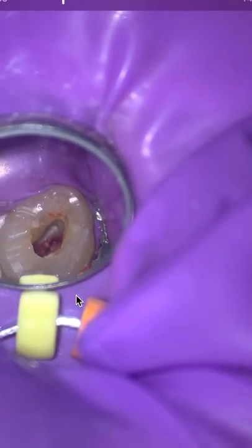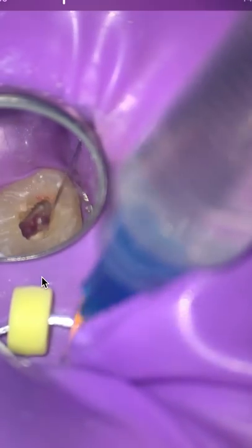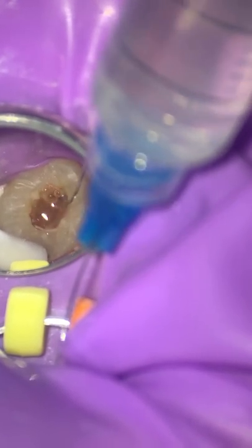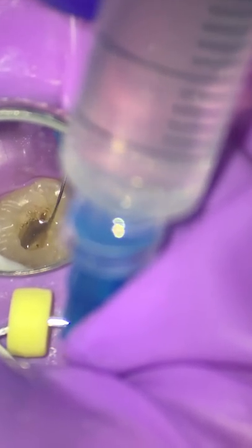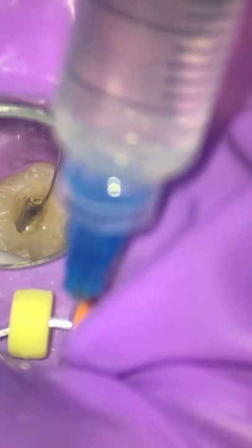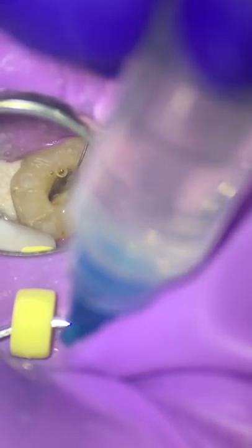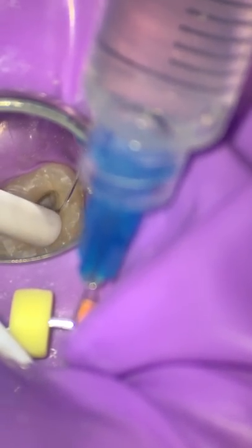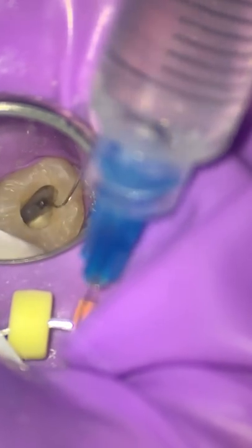I have another case, which I'm not going to put in this video, where the tooth had been sensitive to cold since the restoration for the last 2 years. Once we popped into that tooth, it just started hemorrhaging like crazy. But it stops. I'll see if I remember to put it in at the end of the video. Once you remove all the pulpal tissue effectively from the apical third, boom, the bleeding stops. You can see what's going on. It's amazing. I was just talking about it this morning with one of the new dentists I was mentoring.